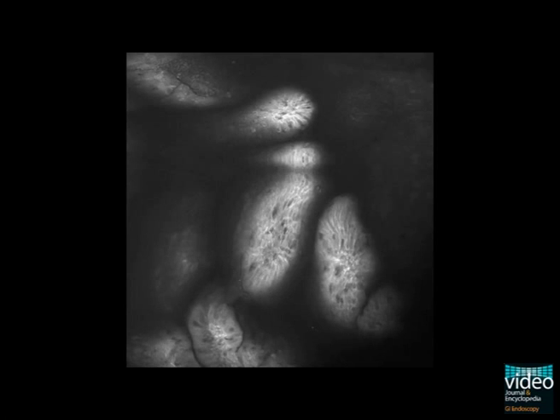When screening the surrounding mucosa further, a completely different mucosal pattern is observed. Intestinal metaplasia is identified by columnar absorptive cells with brush border. The mucosa has a villiform appearance.